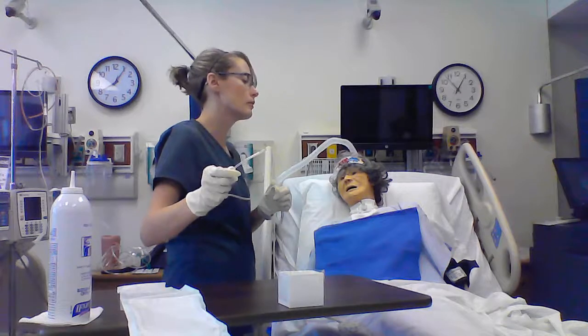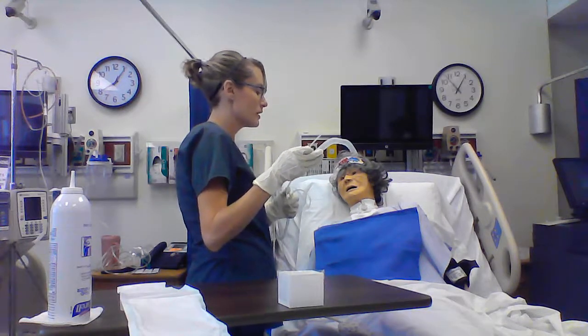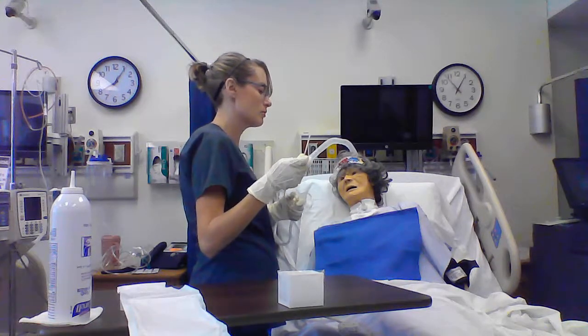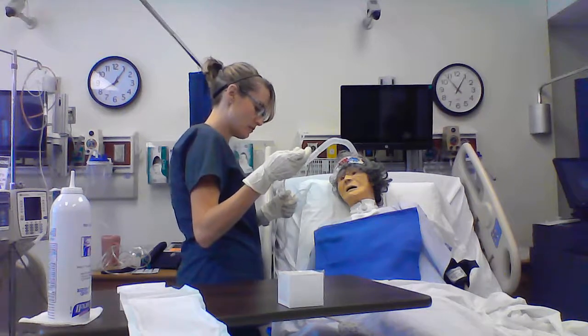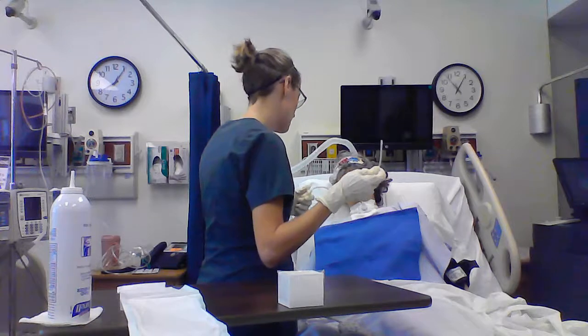And then I'm going to let her know that we are going to get started. I would like Miss Opal to raise her left hand if she's at any time under distress or in pain or needs a break. That way we have a method of communication since she can't speak with me. And let her know that we're going to go ahead and go down in suction.